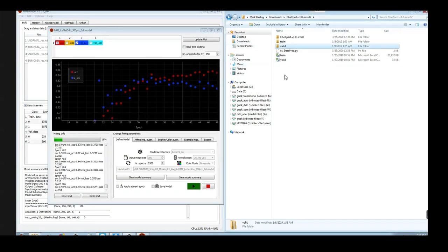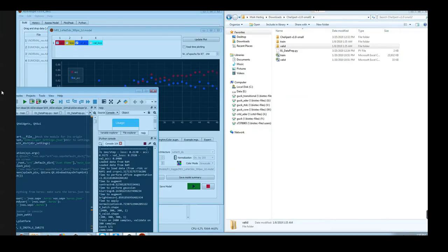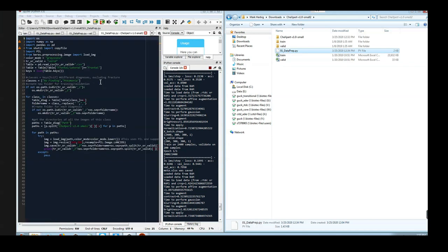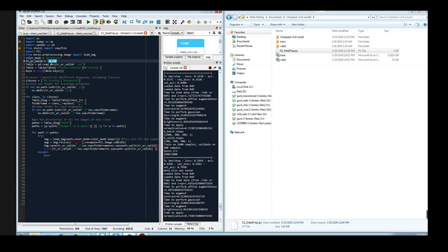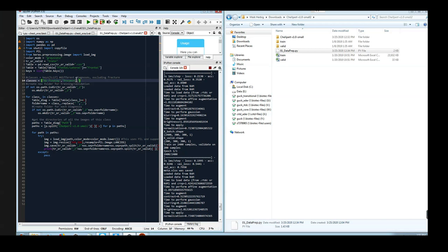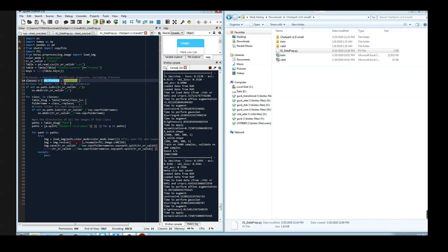Again, I wrote a Python script which will allow me to prepare the dataset. In this Python script, you first have to indicate whether you want to work on the training data or on the validation data. Next, the Excel file will be read, and only those rows are selected which point towards X-ray images that are acquired in the frontal direction. This dataset actually contains multiple different diagnoses, but I just need the diagnosis 'no finding' and 'pneumonia,' which is why I define these classes. If you want to obtain all the classes, you could run this line instead of this one, but I don't want this, so I just want to get those images that refer to 'no finding' and 'pneumonia.'